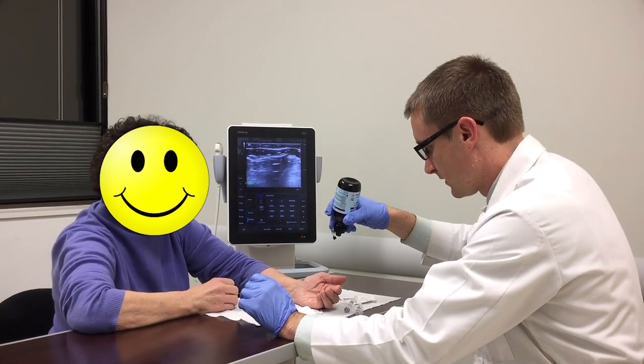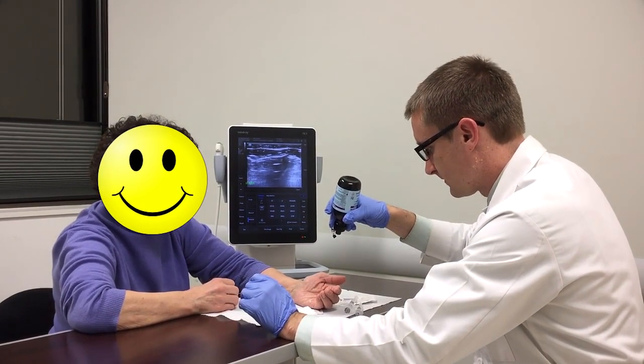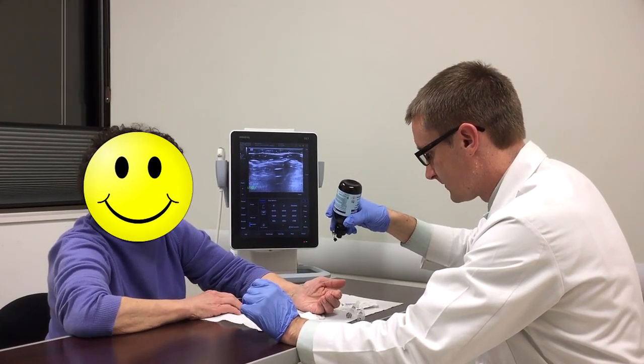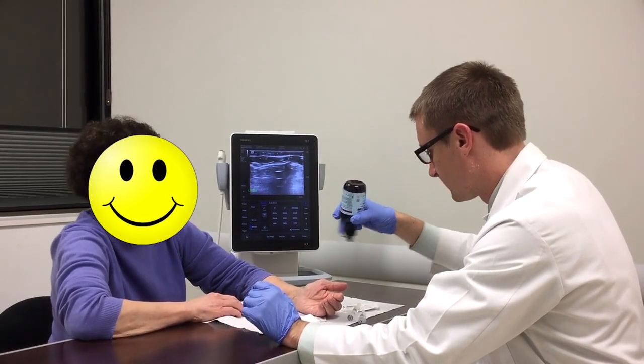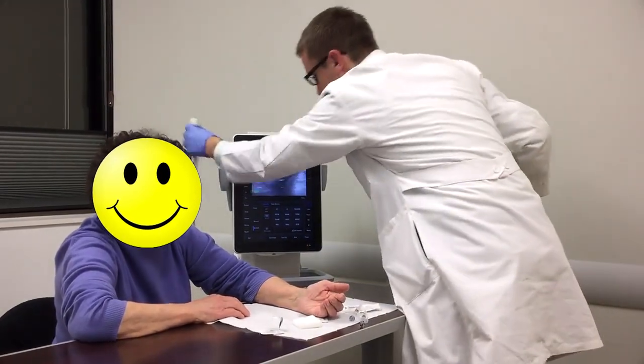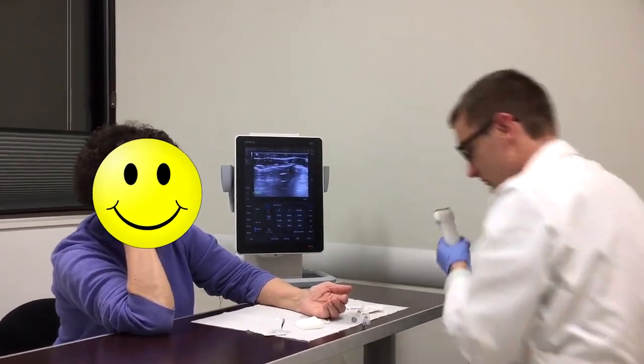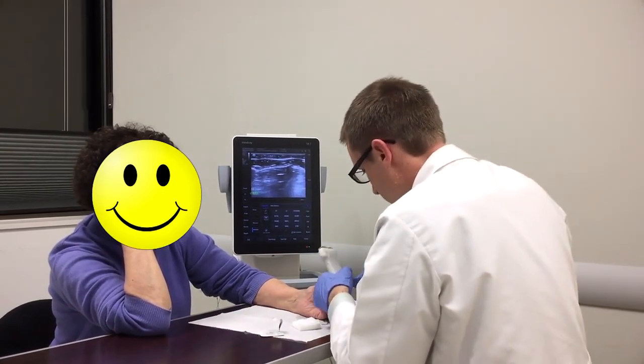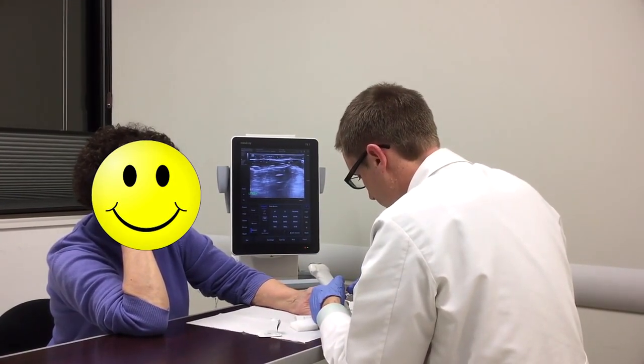After cleansing the skin with alcohol, ethyl chloride, also known as cold spray, is used to anesthetize the surface of the skin so that ideally the patient doesn't feel the 30 gauge needle when it is inserted. It should be noted that neither the ethyl chloride nor the alcohol swab must be applied to the ultrasound probe because alcohol causes damage to the probe.